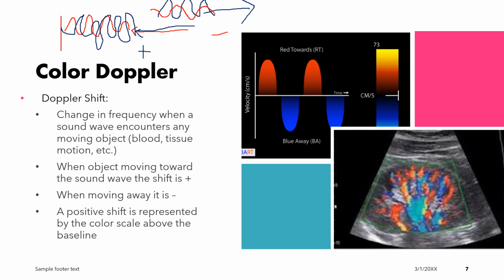So our system, through some amazing calculations, through the Doppler equation and something called autocorrelation, is able to assess these Doppler shifts very, very quickly, and apply color where Doppler shifts are detected, while producing a B mode image behind it where it's looking for just general echoes and not assessing for Doppler shifts.